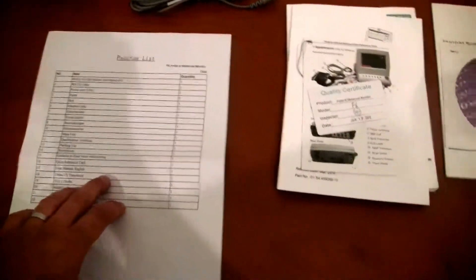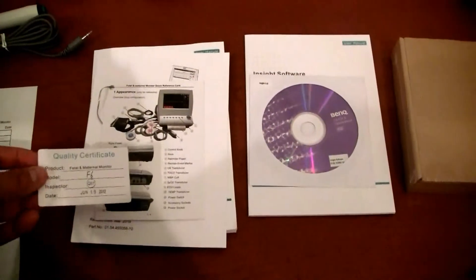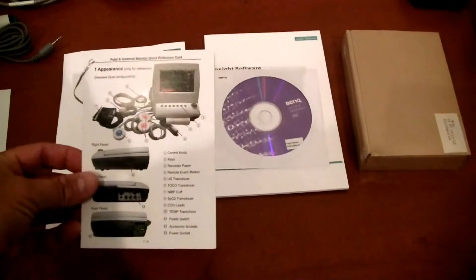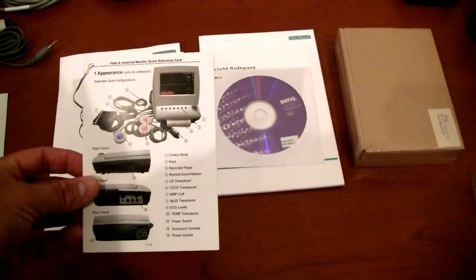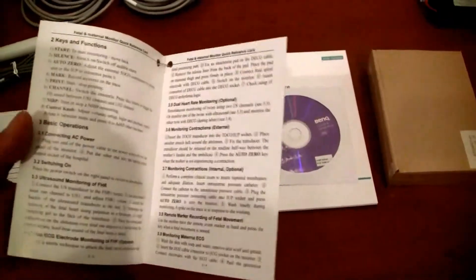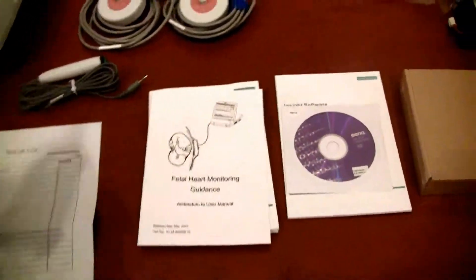When you unpack, take your packing slip out and make sure that everything is in the unit that's supposed to come with it. There's also a quality certificate. There's a shortcut guide or quick reference guide that goes over a lot of the accessories as well as some of the functionality for the keys, giving you a head start on the user interface.